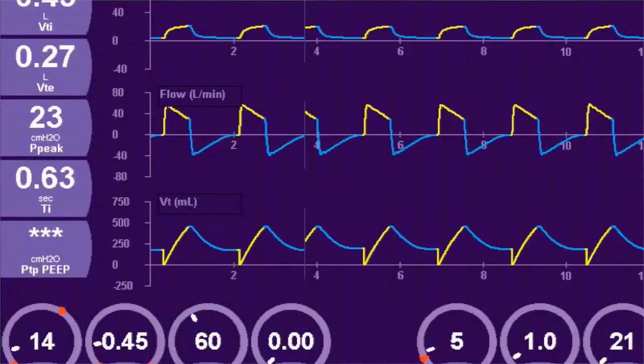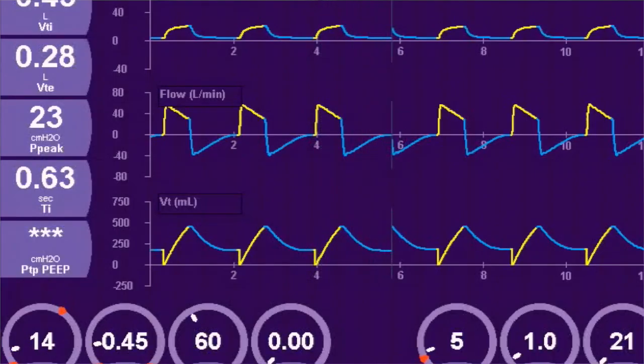While you may be able to define auto trigger just by memorizing the definition, it's very critical that you recognize how it is displayed on the ventilator. Auto trigger, by definition, is when the patient is not generating the breath. So you don't have a patient-triggered breath, and all of a sudden you see a very rapid respiratory rate.